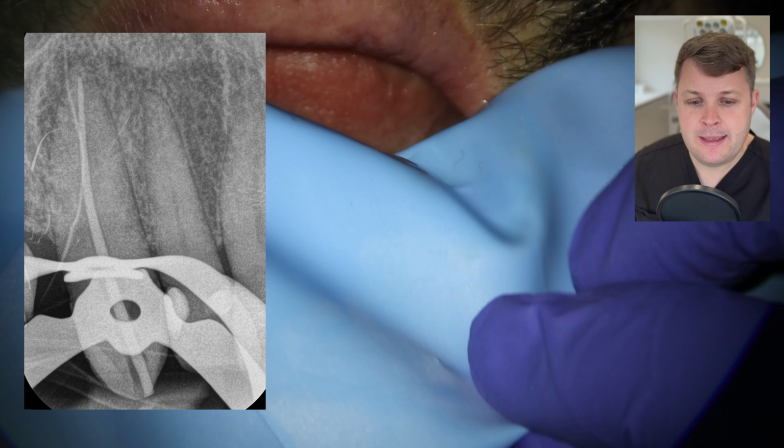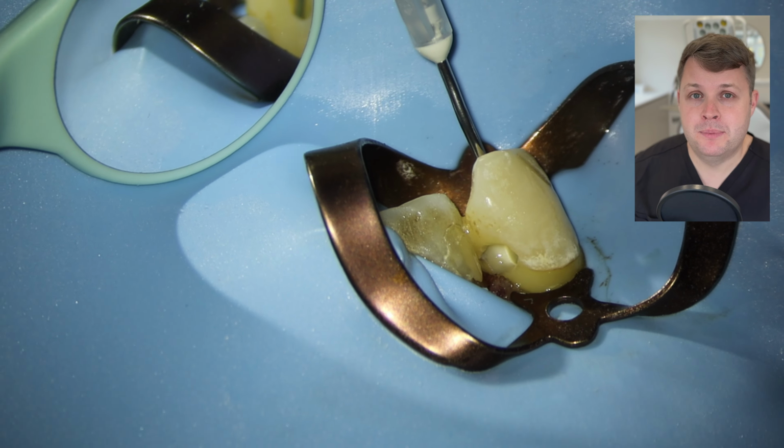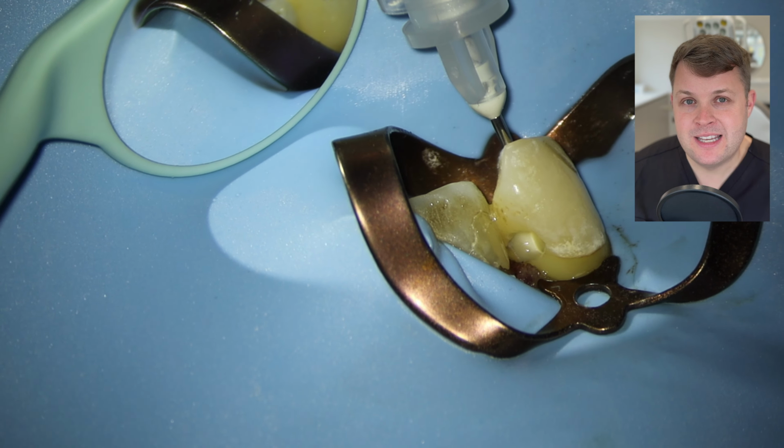I'm now going to use this new tip. Instead of having a plastic sleeve on it, it's now got a metal sleeve on it, and it's actually quite useful. And this goes on our bioceramic. But the problem with this, of course, is it's a very long canal. So I'm going to place this bioceramic tip quite far down the canal, so it's hard for me to visualize how much I'm using. So I do a first sweep with the bioceramic and notice that I haven't been pushing the plunger down hard enough, because I'm not used to this new metal tip.